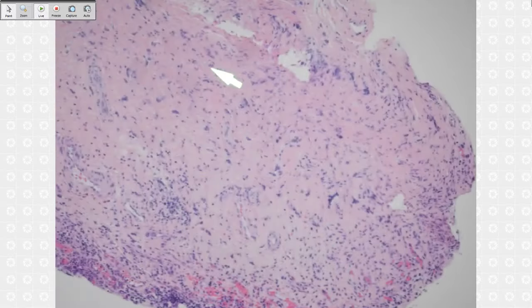I don't know if the patient had bladder radiation therapy before surgery. No, right? But remember he mentioned radiation-like stromal reactive changes. Desmoplasia is rare, but cellular fibroblastic change is one of the reactive changes. And sometimes you just see really huge stromal cells in bladder biopsies. But I would do the immuno now since it's so scary.